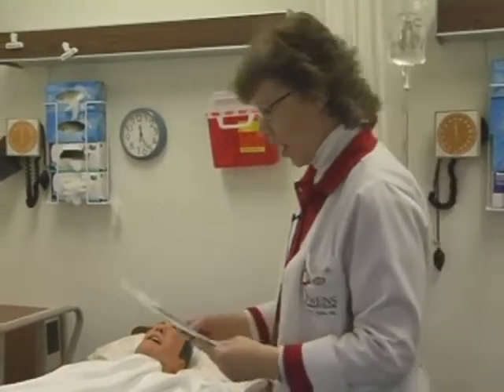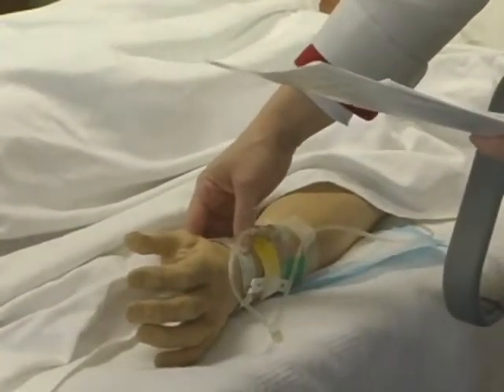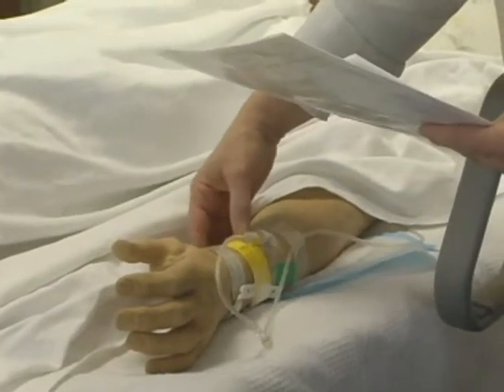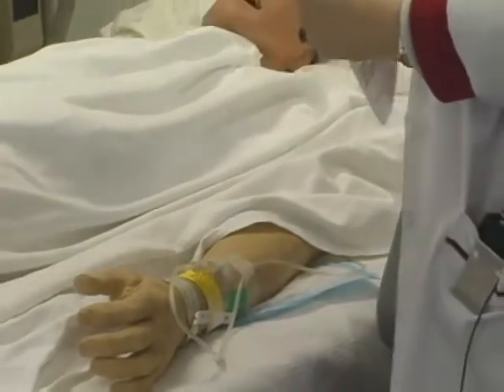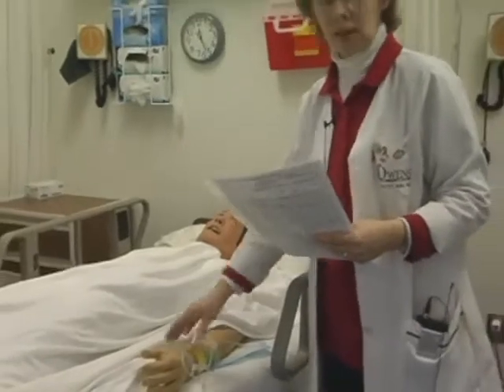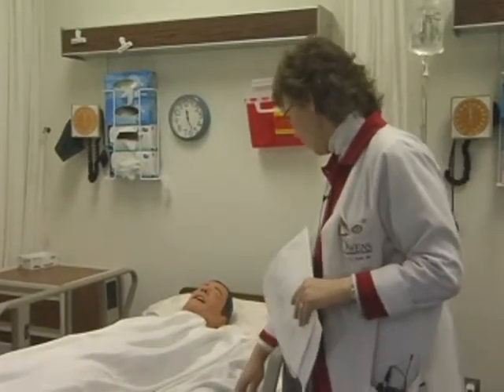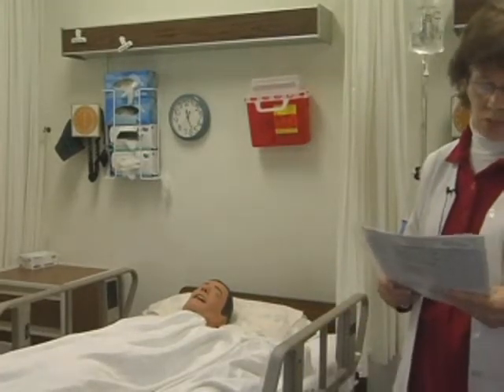So I would take my MAR and compare his ID band. Harmon Wagner, ID 47672. I'm going to check his allergy band. He's allergic to tetracycline. And I would ask him, do you have any allergies, Mr. Wagner? And we've already checked this to verify it. Mr. Wagner, today we're going to give you an IV medication through your line. And I would explain what the medication would do.